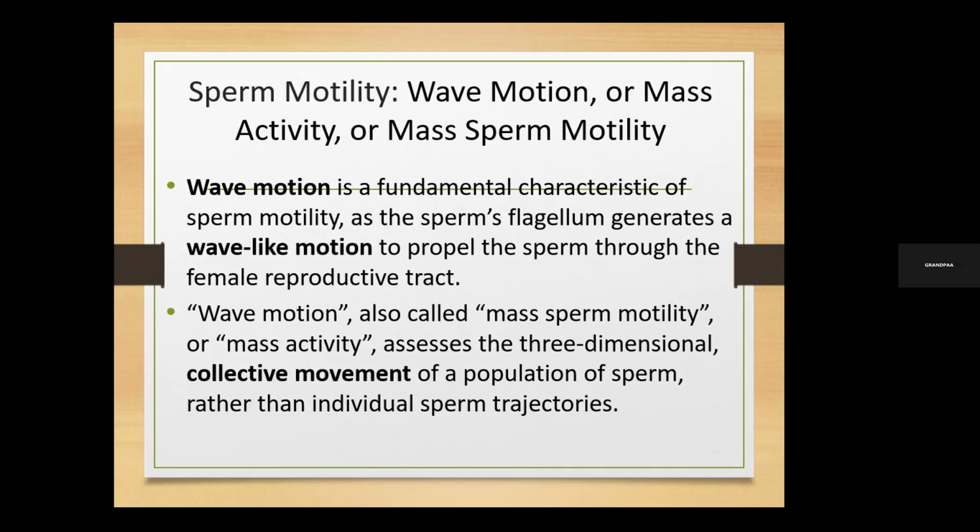The fish under the water is moving, and its movement is creating certain waves that become visible on the surface. You know that sperms move. So once they move in a fluid environment, they should create some kind of wave, with that kind of heavy movement. That is called wave motion, and it is a characteristic of sperm motility.